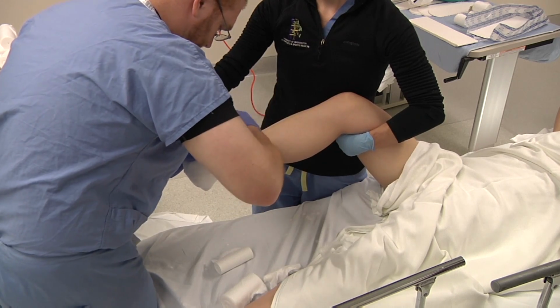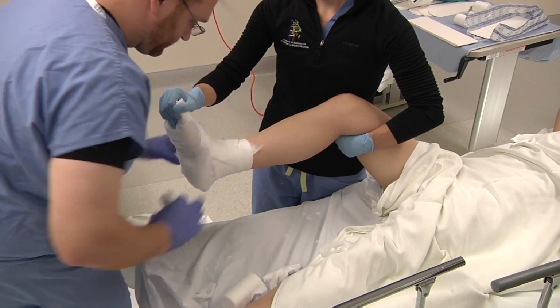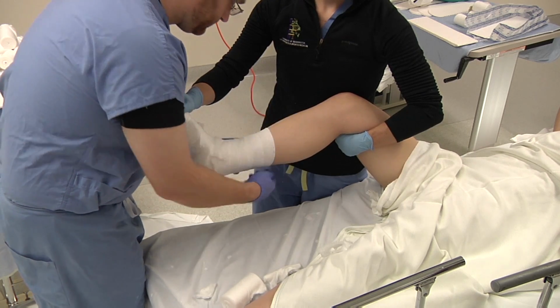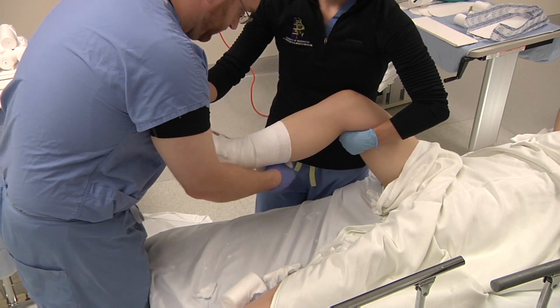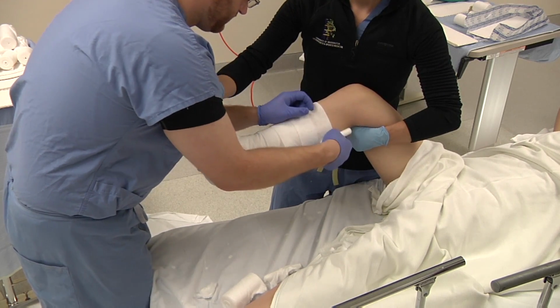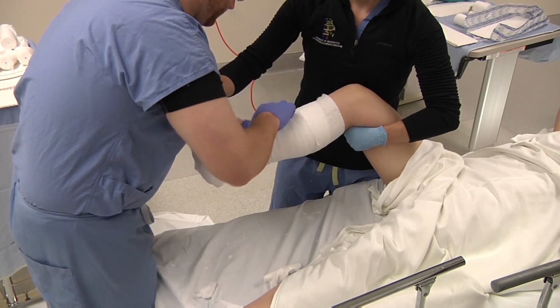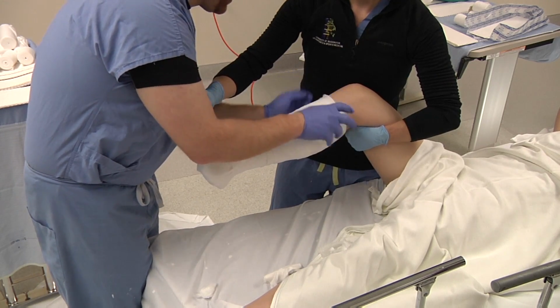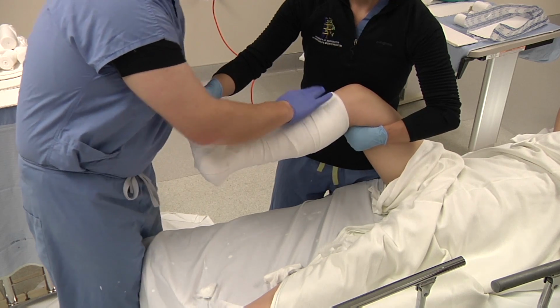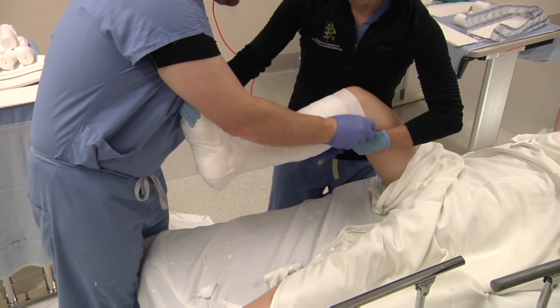It's also very important not to get too much bulk where there's creases, as that can cause compression. We work up the leg with a minimum of 2 layers. We've also, prior to any splint application, evaluated, cleaned, and dressed any wounds or burns. Try to get up as high as we possibly can.